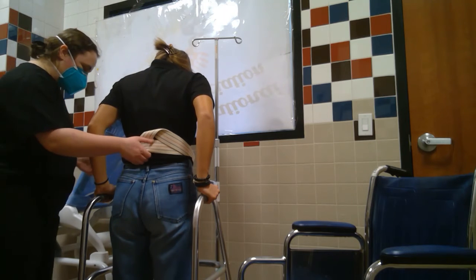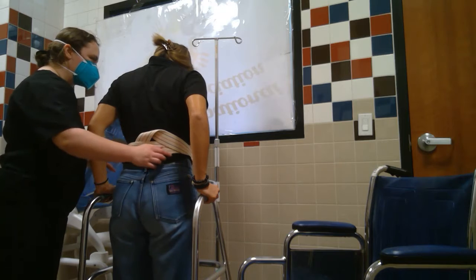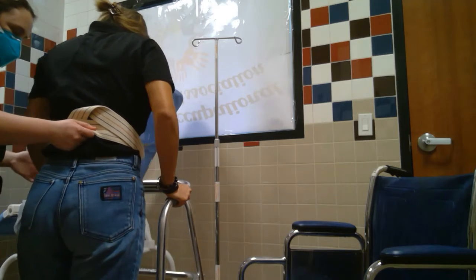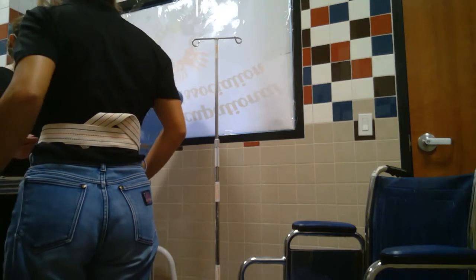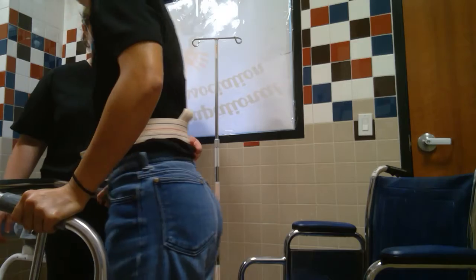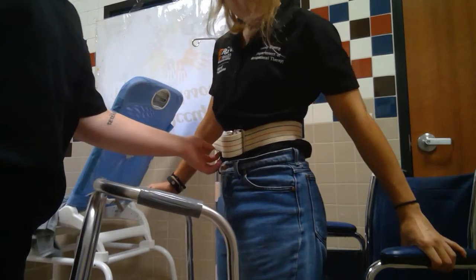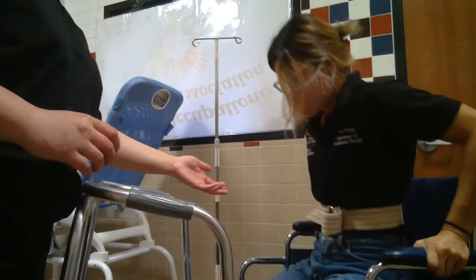And so can I have you, the opposite way, you're going to lead with your strong leg now. So go ahead and move back. And then you can move the walker back. And go ahead and turn safely as you can. And then go back until you feel the wheelchair. And then same thing, reach back for that arm. Make sure you keep that leg out and slowly sit.